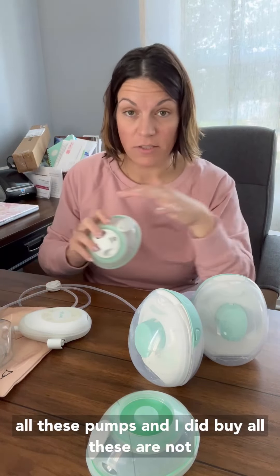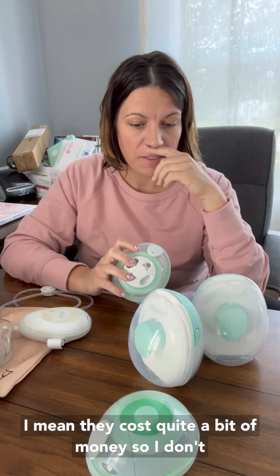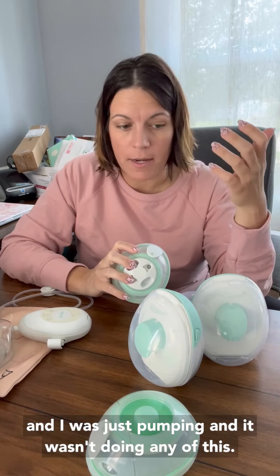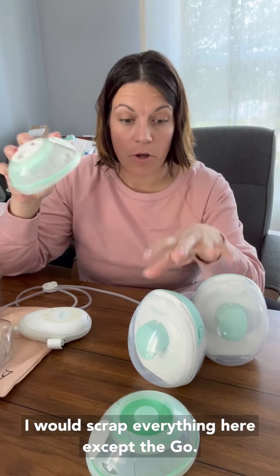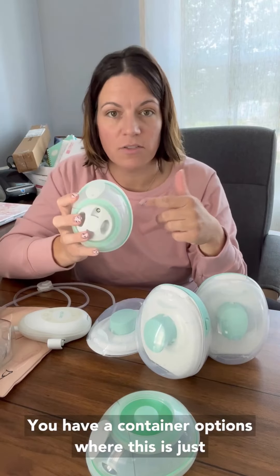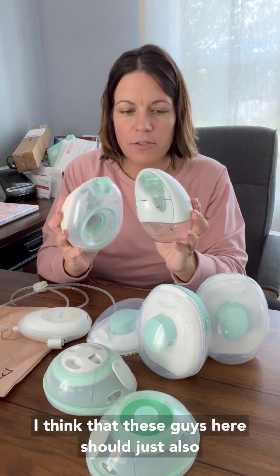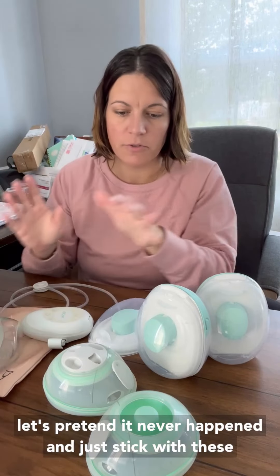I did buy all of these — they are not gifted — and I didn't buy them all at once. They cost quite a bit of money. I don't regret it; I'm glad I have them here to share with everybody. But if I had to do it all over again and I was just pumping, I would scrap everything here except the Go. I like the Go a lot. I like that you have container options, whereas the 3.0 isn't even a possibility. And these guys here should also just be forgotten about. Let's pretend it never happened and just stick with the Go.